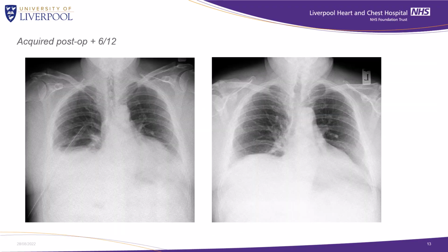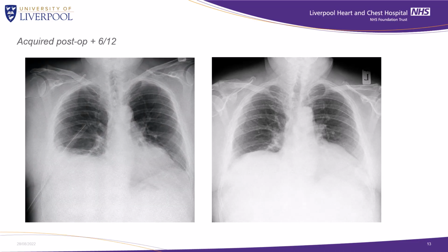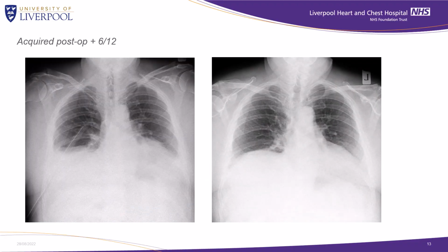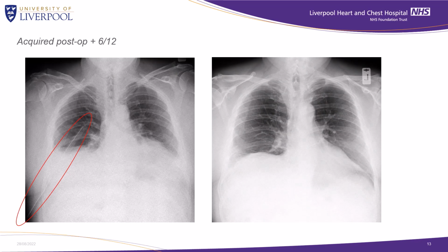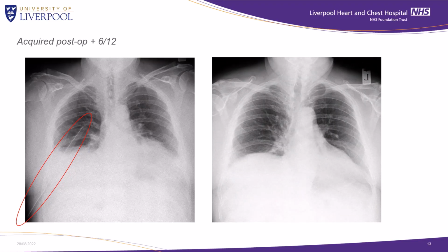Here's the series post-op. The first was acquired soon after elective hemidiaphragm plication, and the second some months down the line. Again, we can quantify and chart the change in diaphragm motion between these studies. The first was actually acquired so soon after the procedure that you can see an intercostal drain in situ. This wouldn't be possible with spirometry and would be difficult in our fluoroscopy suite. Improvements in diaphragm position were consistent with patient-reported quality of life and symptoms post-procedure.